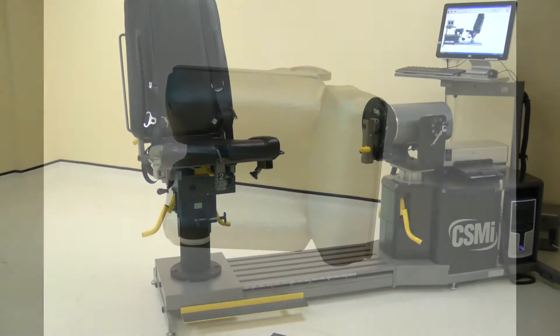The position of the chair is not vital for this test, as long as it does not impede the motion. The chair can be used to hold on to for stabilization if required. In these circumstances, adjust the chair to allow the subject to hold it.